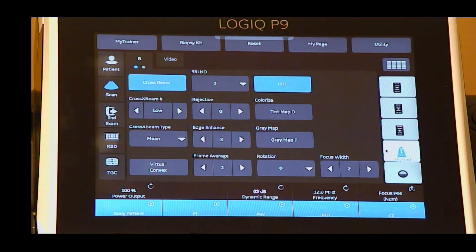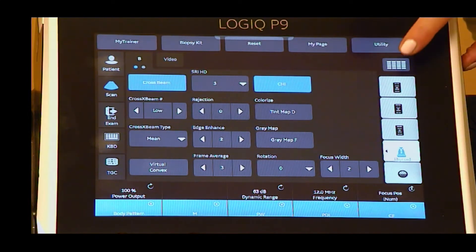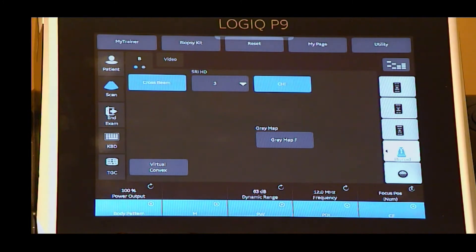The touch screen has many parameter options. Some of the most common options you will adjust in B-mode imaging are cross beam, also known as compound imaging.